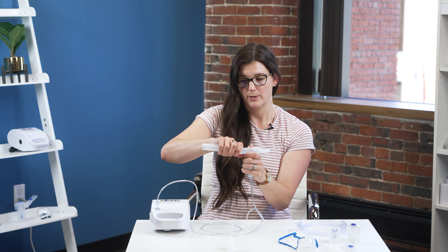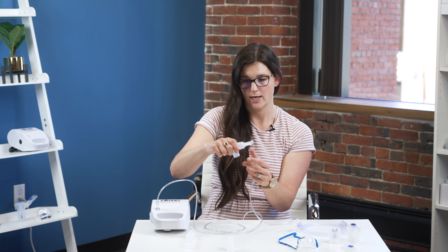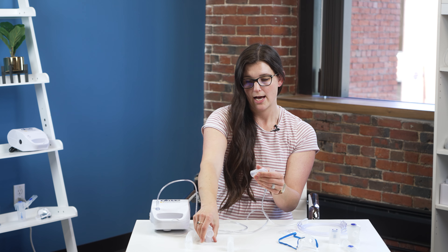If you're not using the mouthpiece, all of that goes to the side and we have an adapter to use the pediatric face mask. The adapter has one side with ribbing and one side without — the side without goes right on there, pushing down. Then you take the face mask, with the side with the ribbing going on there. Again, making sure that the holes of the face mask are facing down.